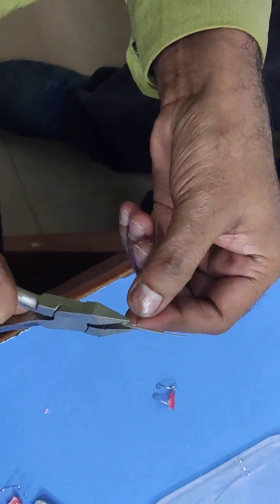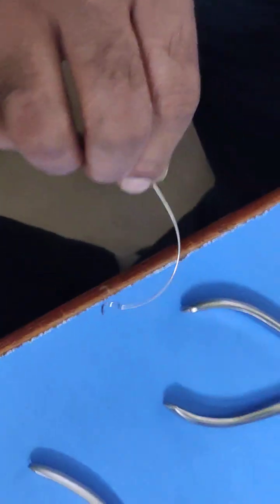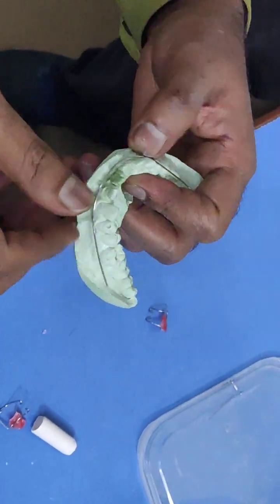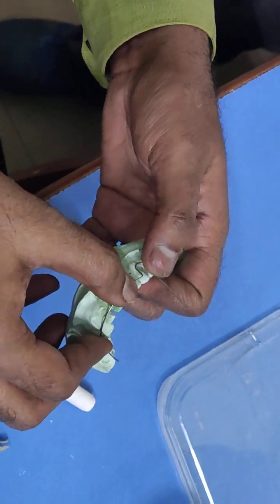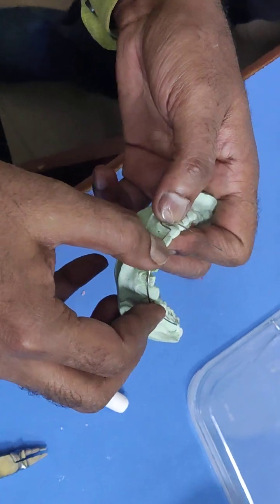Most of the times during bending, so that now it looks like that. You see from above, yes, now it is on the same plane, on the same curvature. And now you again place it, keeping it in the middle. Now I will bend the crossover wire. It is also known as the crossover wire.